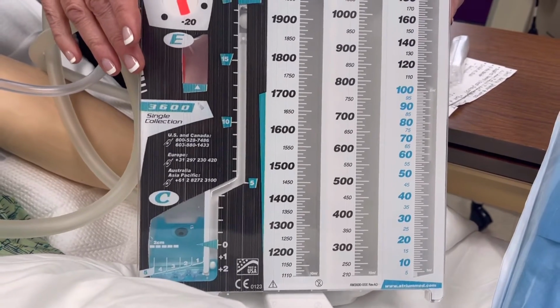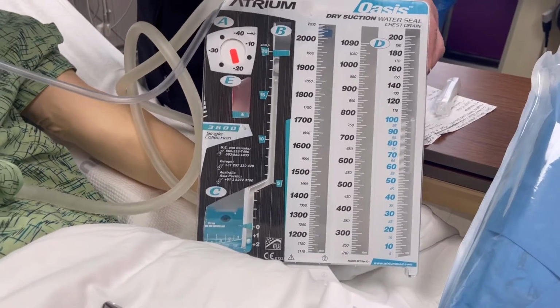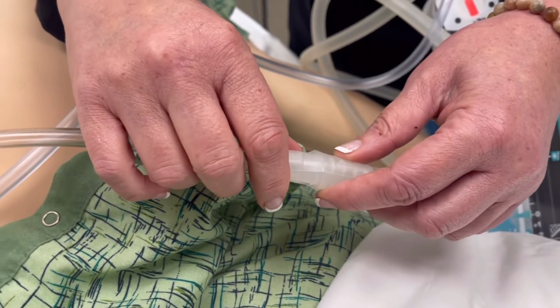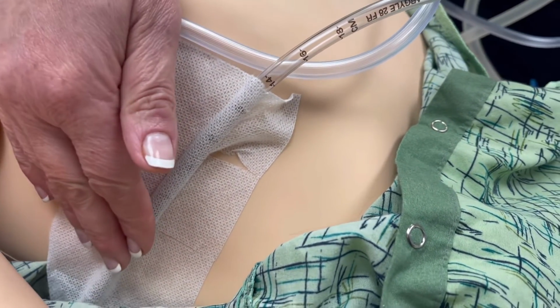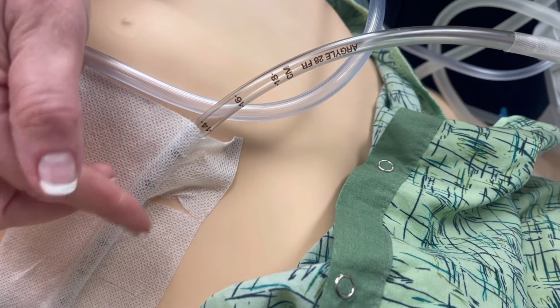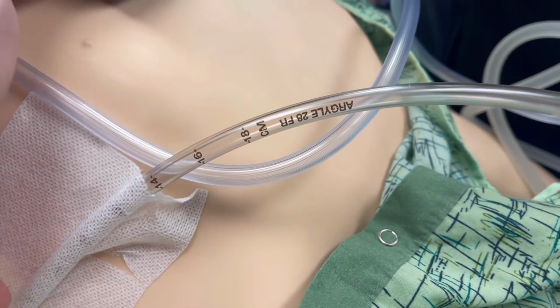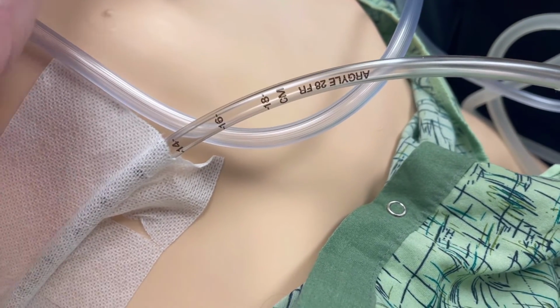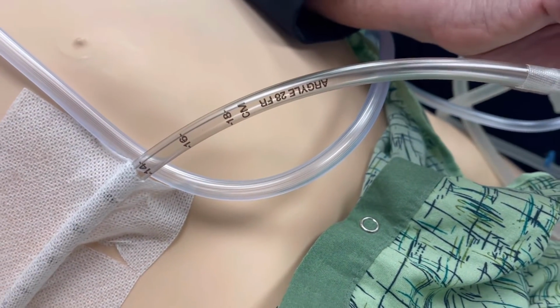The first thing that I want to do if I do note that there is an air leak is I want to check all the connections on the tubing. So I want to check here, make sure that this hasn't gotten loose or gotten disconnected. You want to check the entire lumen of the chest tube all the way to the entrance into the chest. You don't have to remove the dressing at that point, but you will want to look for any kind of holes, and if you can't resolve it, you would strip it all the way down under the dressing and make sure none of those holes or little lumens at the end of the chest tube, which is how the drainage enters into the system, is outside of the chest, because that would create a continuous air leak.